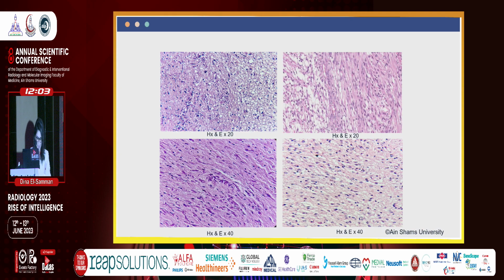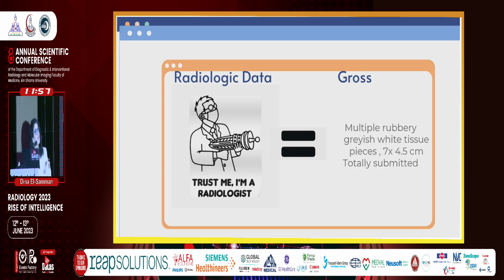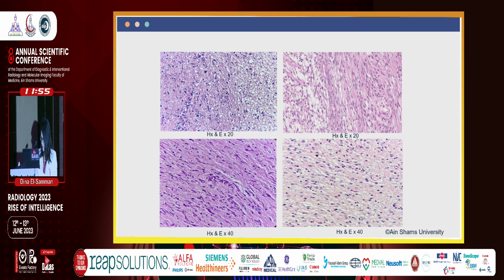Okay, so let's see what we have got here in the microscopic picture. This is, where's the pointer? I'm sorry. Can I use my laser pointer? One second. Okay. That?